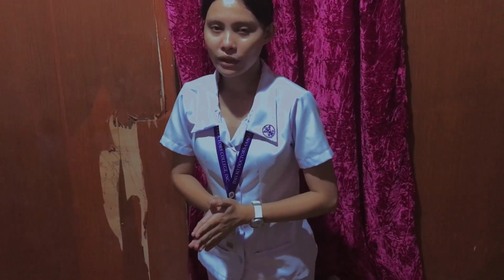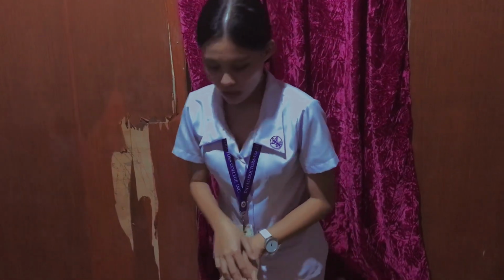Now let's assume that I am the second rescuer. The second rescuer brings the bag mask. At the 5th set of compressions, we're going to switch roles. I am going to do compressions that contain 15 compressions in 9 seconds. We're going to use the thumb to thumb technique.